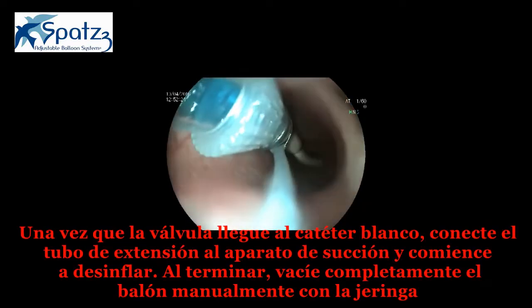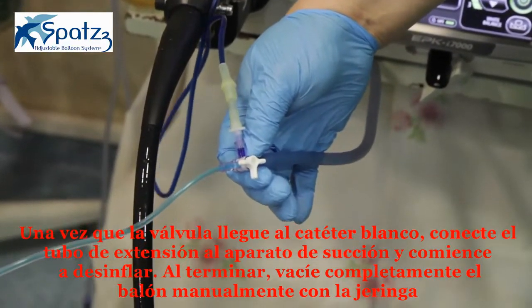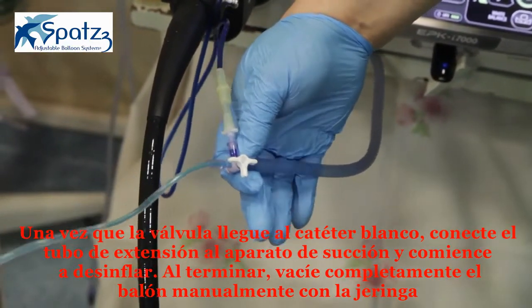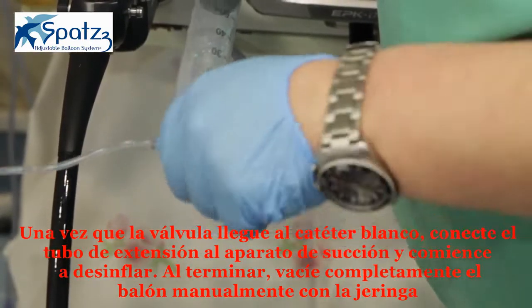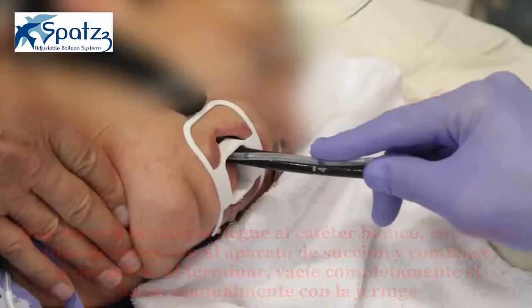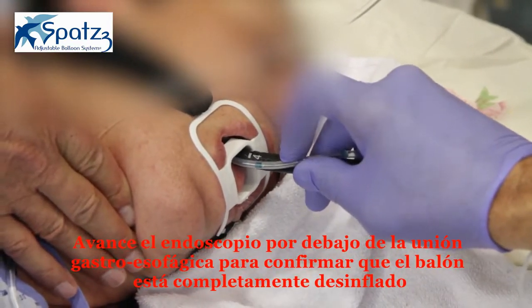Once the valve reaches the white catheter, connect the extension tube port to the suction and start deflating the balloon. When completed, drain the balloon manually by syringe. Advance the scope below the gastroesophageal junction to confirm complete deflation of the balloon.